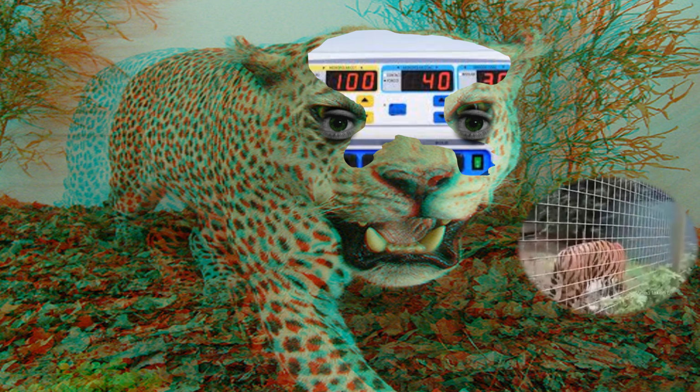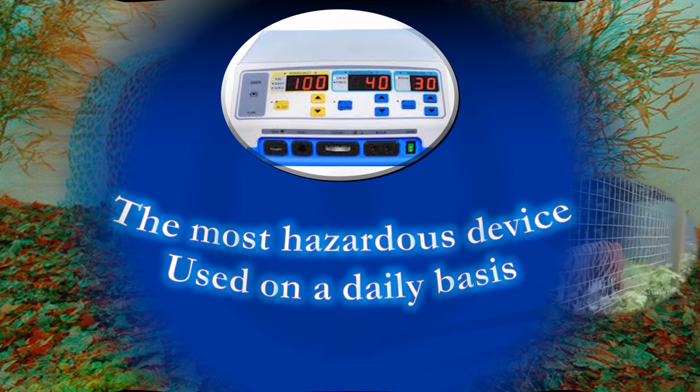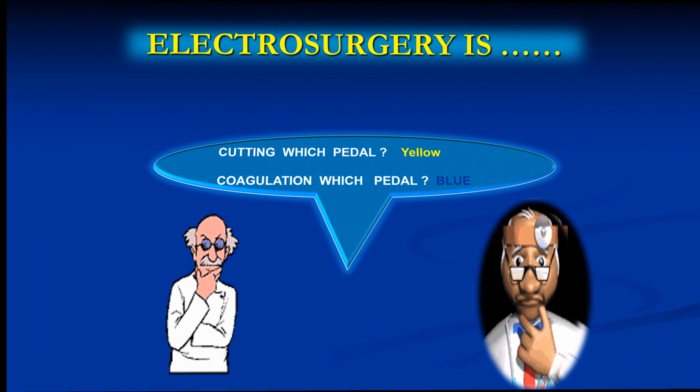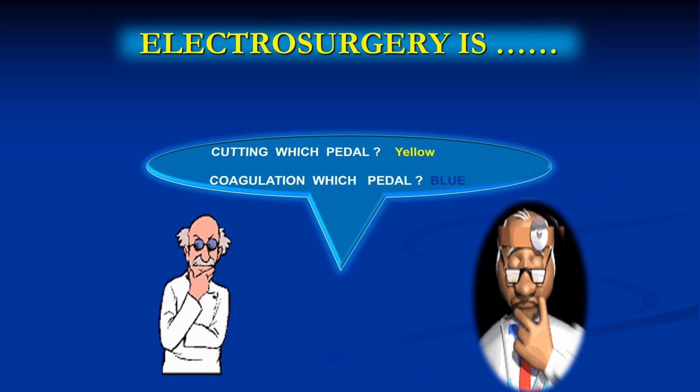Electrosurgery unit, one of the most hazardous devices used on a daily basis. Evidence shows that many surgeons have a gap in their knowledge of the basic principles of electrosurgery, which can compromise patient safety. Physicians using electrosurgery must be knowledgeable about prevention and management of potential complications of electrosurgical procedures. In addition, they should understand the mechanism of action and how to troubleshoot equipment.